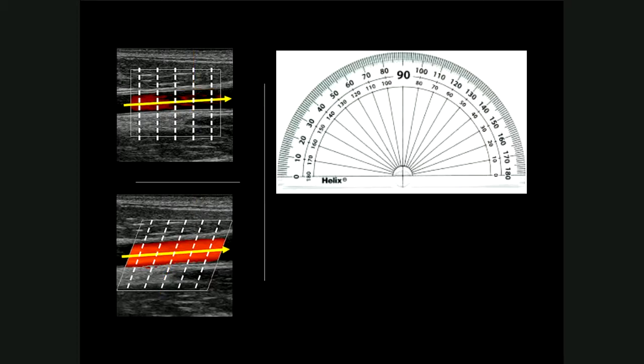Okay, so that's the end of color. So color is very similar to pulse wave. It's just color coded and then superimposed on the actual anatomical display.